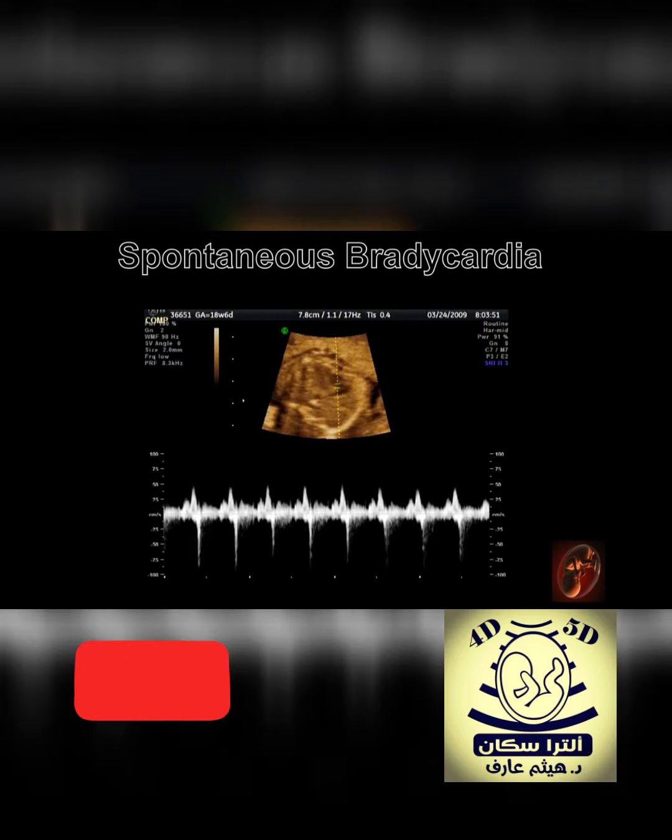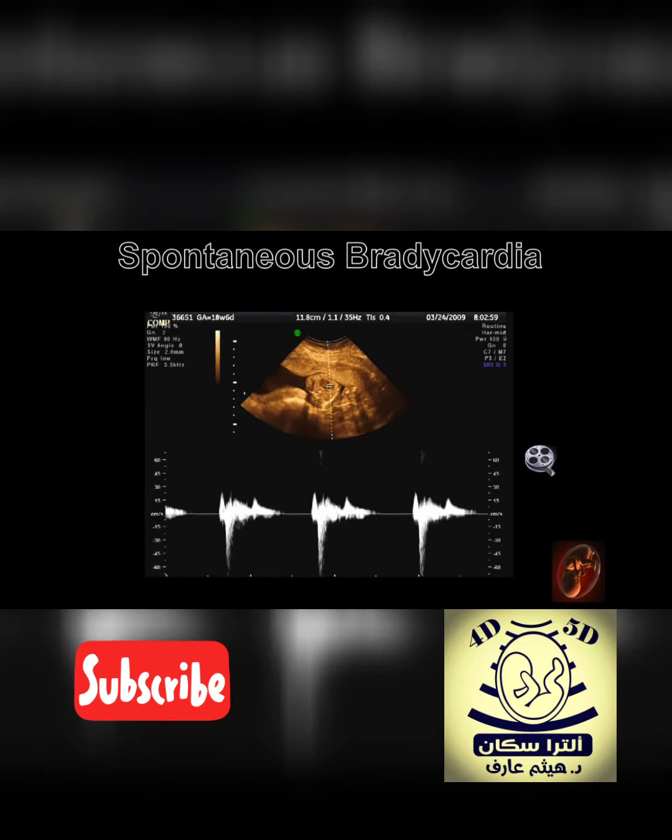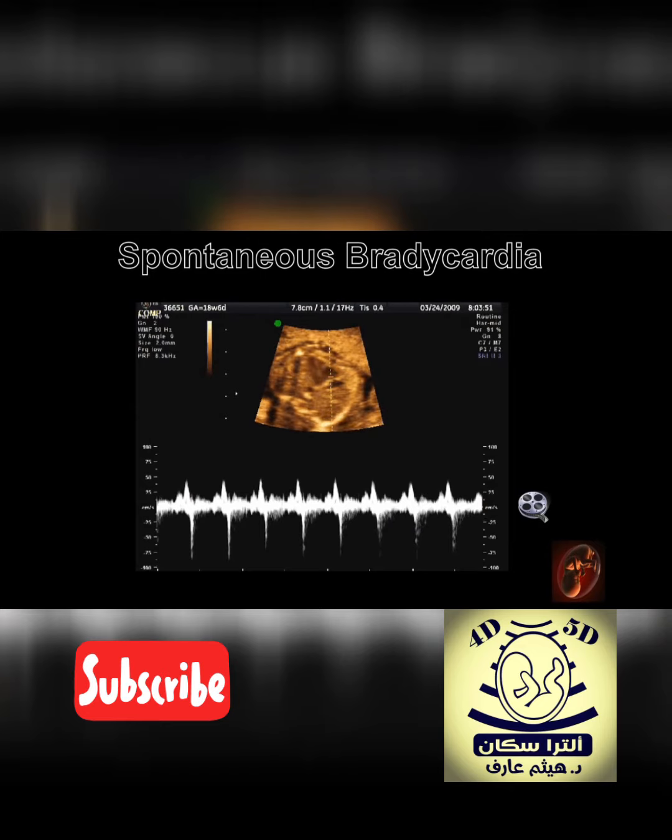This is a normal heart rate of 140 beats per minute in a fetus that is 18 weeks 6 days. The recording is a pulse Doppler waveform from the ventricular inflow and outflow tracts. This Doppler recording demonstrates bradycardia of 60 beats per minute, the return to a normal baseline heart rate. This is a cine clip demonstrating a normal rhythm followed by the bradycardia described above in the previous slides.